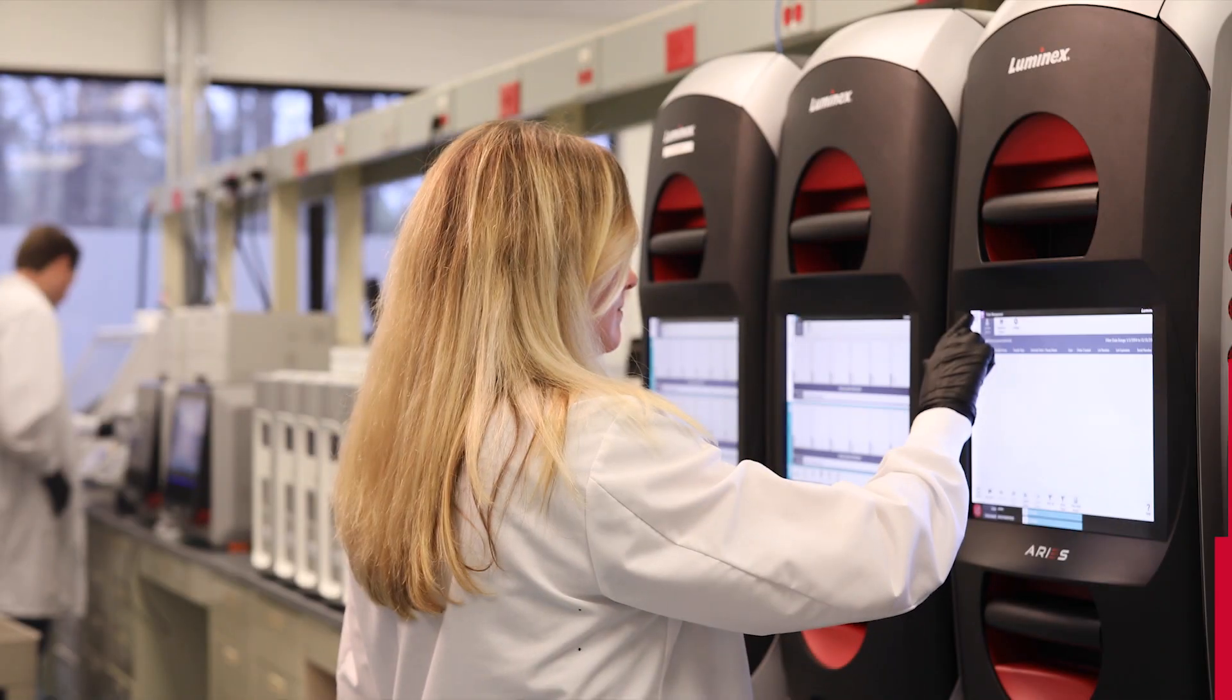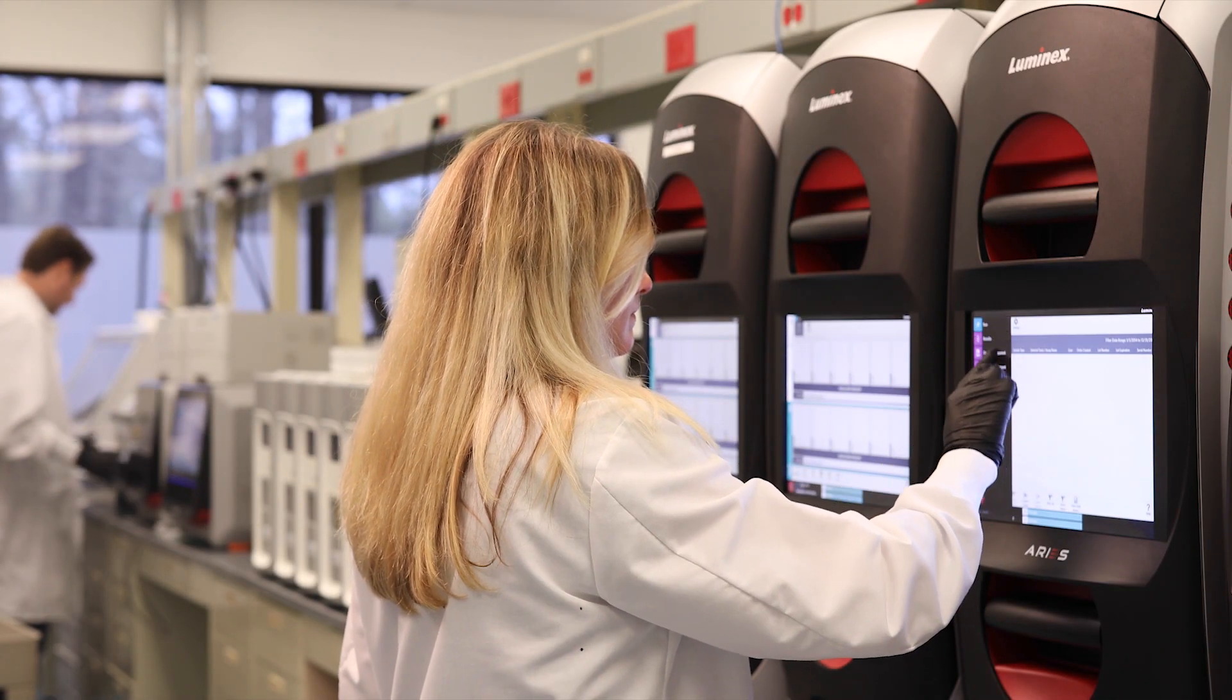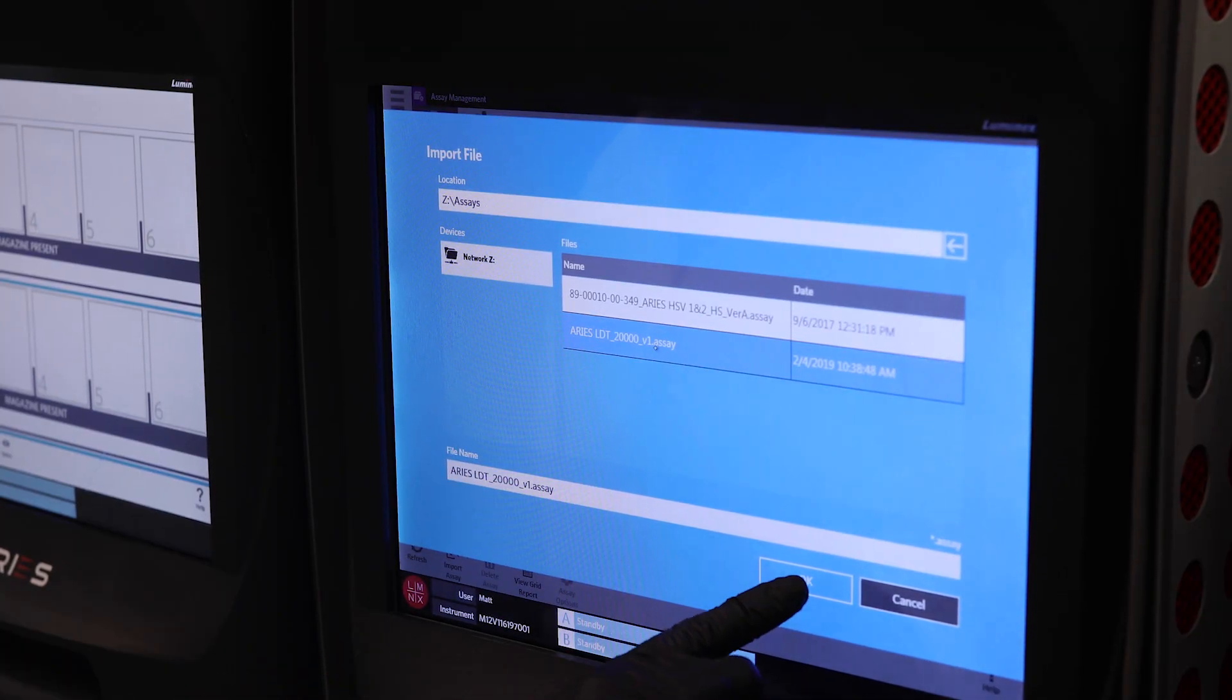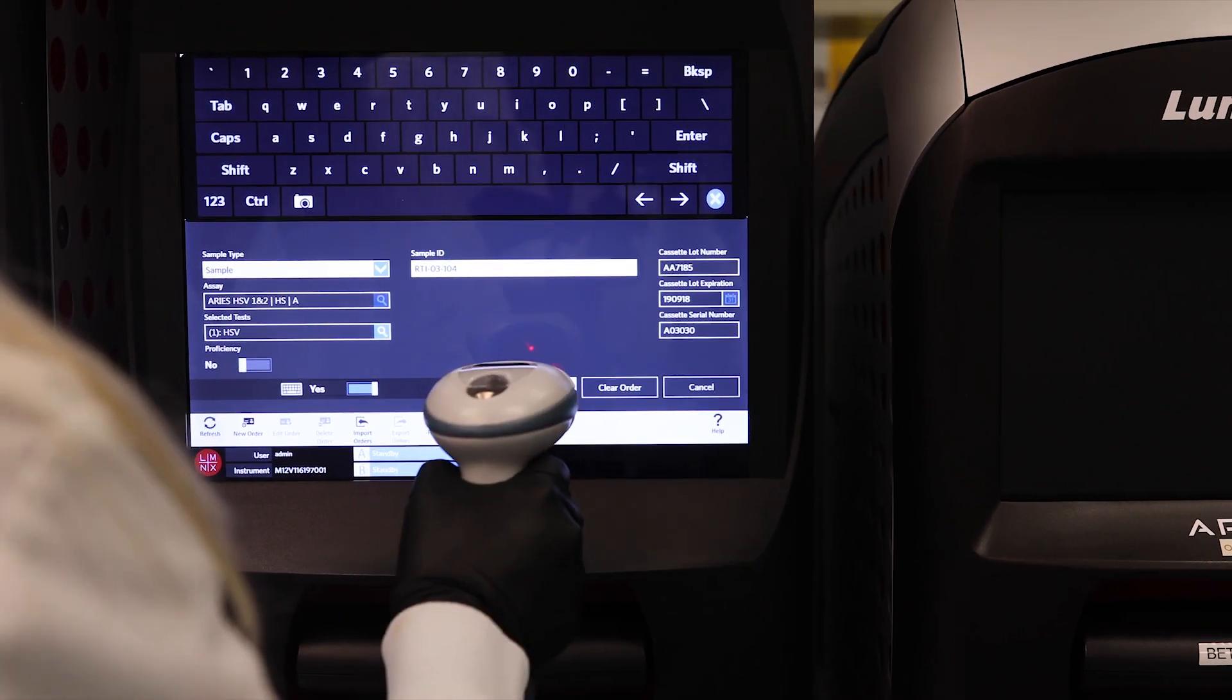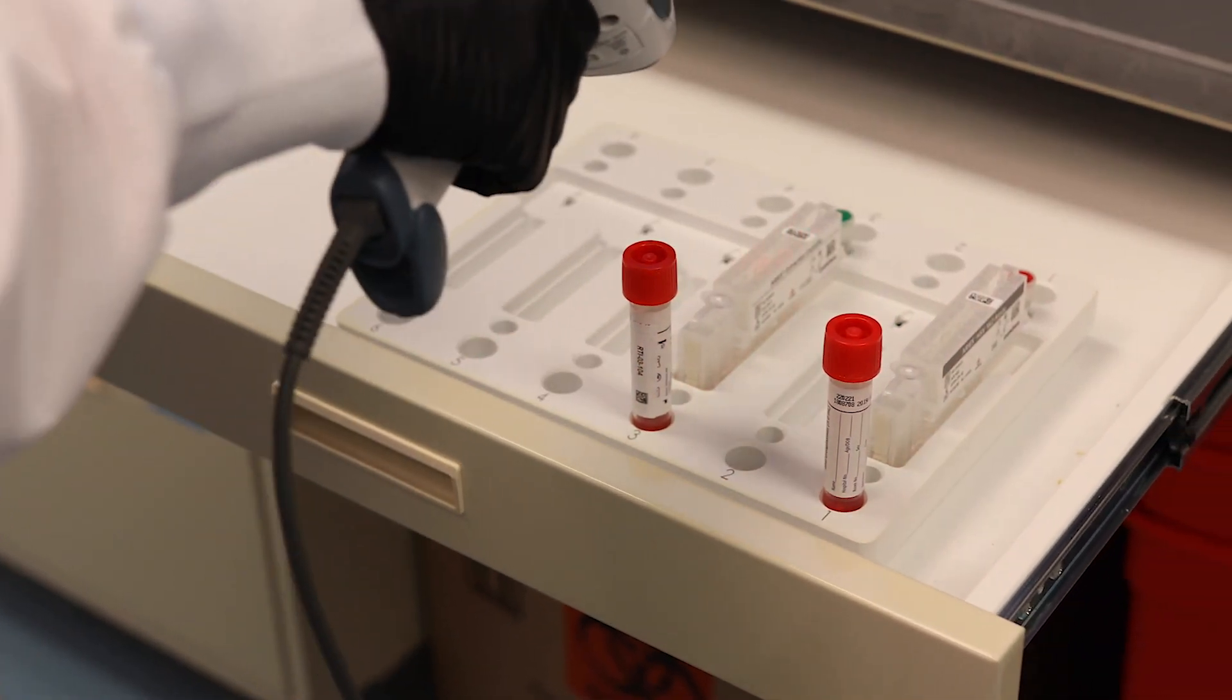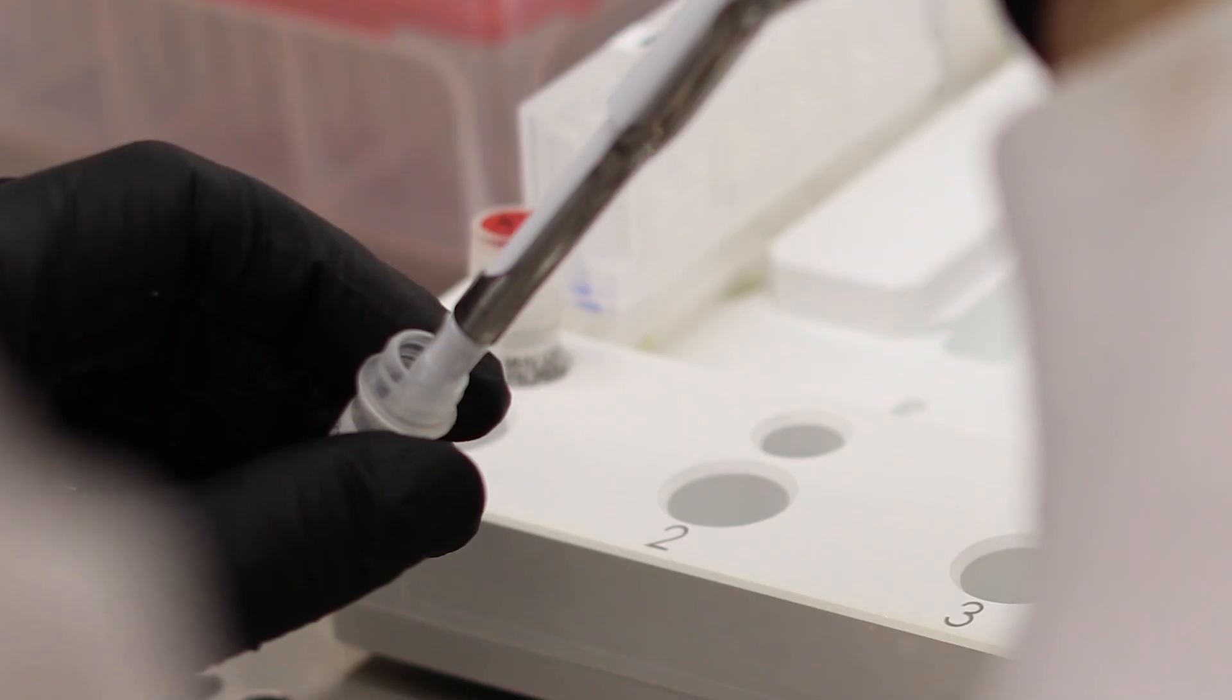The Ares system from Luminex offers you the flexibility to run IVD assays as well as design and run lab-developed tests. Using synced software, you can easily create and run your own assays with the most common PCR technologies including TaqMan and Multicode.